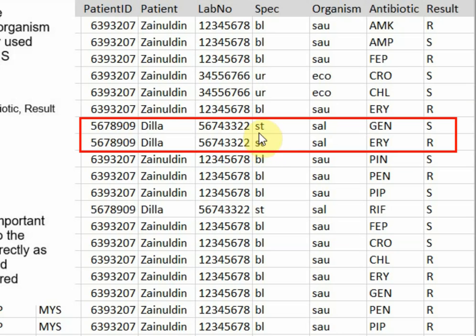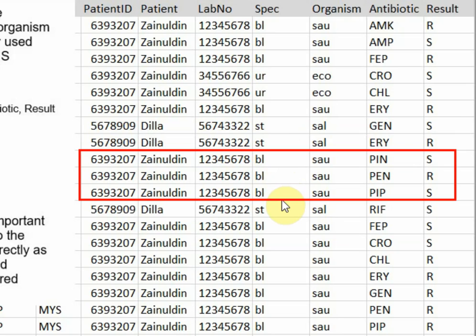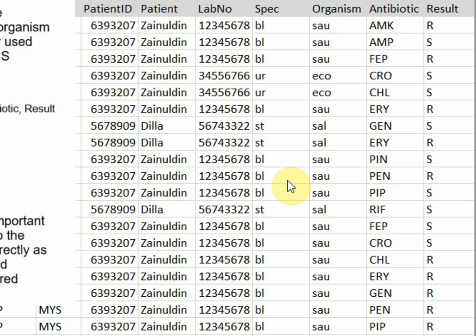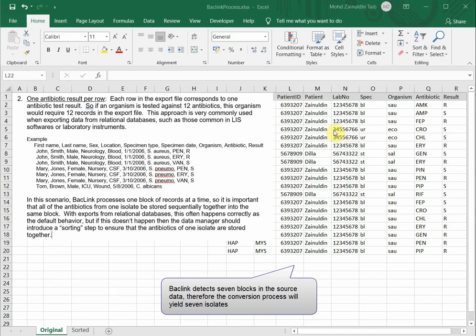Then we have another patient here, which will be another isolate. Then again, it is followed by these three records, actually the same isolate, but we consider it another block of records, therefore another isolate. Again, this patient, stool and salmonella, we consider another block. The last one is also another block. So Backlink detects 7 blocks, and after the conversion process, we might have 7 isolates.